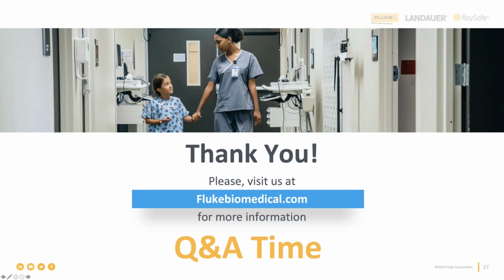The effect that it has on a patient, I remember Katia saying that even the outside temperature can have an effect on temperature. There are multiple things that can have an effect on SpO2, and I touched on a couple of them, but skin color, fingernail polish, finger thickness, all of those things can have an effect that creates that plus or minus 1 or 2%.